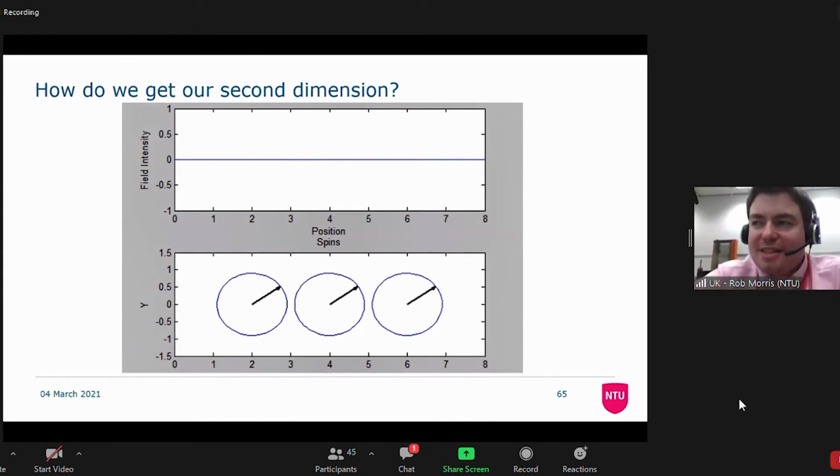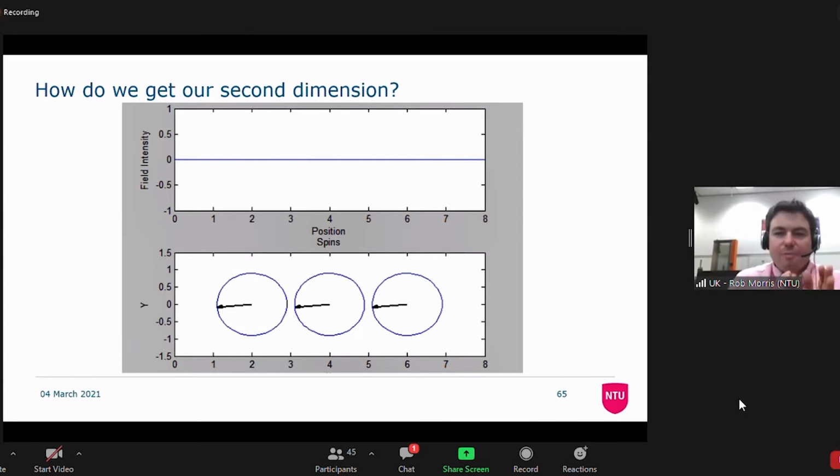The point of this is key to how we really do MRI spatial encoding. So we have, and you've seen this, frequency encoding, and that's really nice, but phase encoding is actually quite a bit more powerful. If I turn a gradient on, not for long, just for a little bit, and then turn it off again, I will encode in space different phases in all of my spins. And they will keep that, whatever happens, as long as they don't move around. If you've got samples that do a lot of diffusion or physically move, like a person, things start to get a bit more complicated.